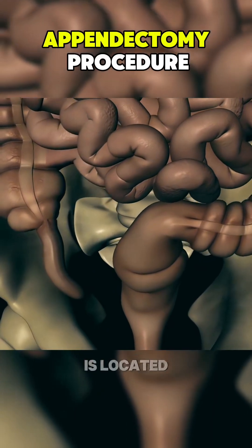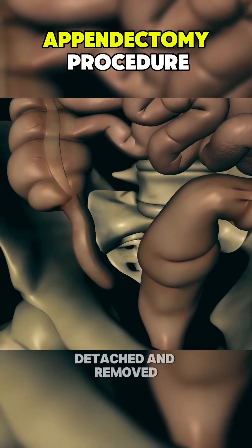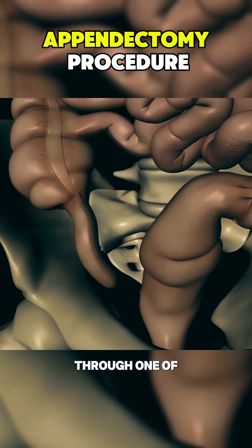Once the appendix is located, it is carefully detached and removed through one of the incisions.